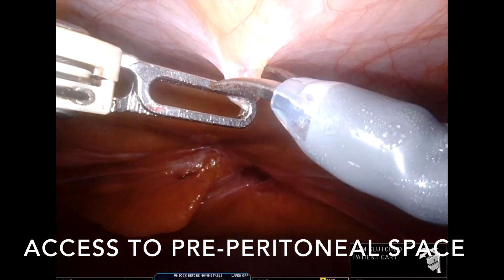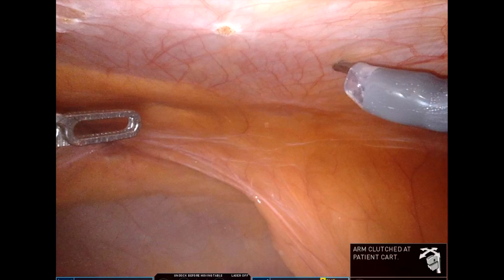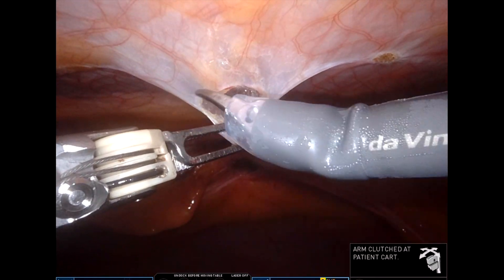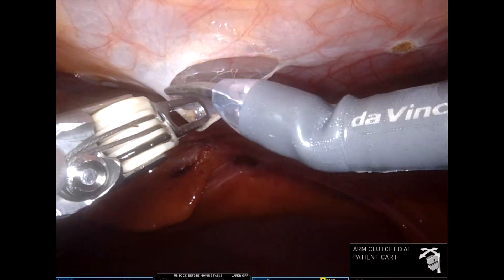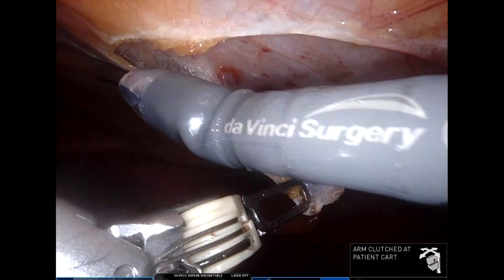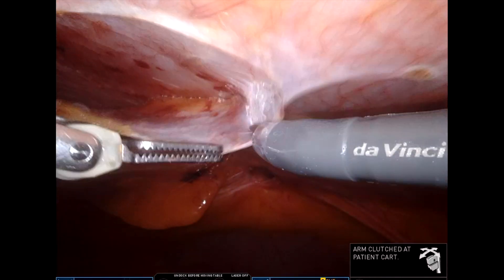We make markings onto the peritoneal surface along the intended line of incision first, and then gain access to the pre-peritoneal space. My camera is at 30 degrees up as we are working on the roof here. The initial incision on peritoneum is tricky, as if one is not careful, you may enter the retro-rectus space and then gaining back access to the pre-peritoneal space is a bit challenging.